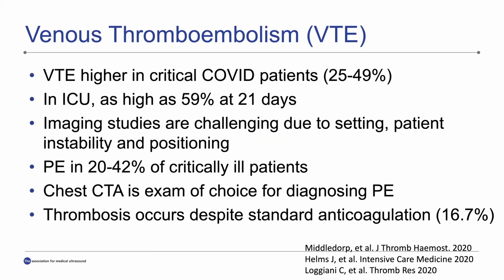Many of them are vented, they're in the intensive care unit, they may be unstable, it's difficult to get them in an optimal position. Of course, the examiner is in full PPE, has to bring a machine in the room. A lot of challenges to examining patients in that setting.